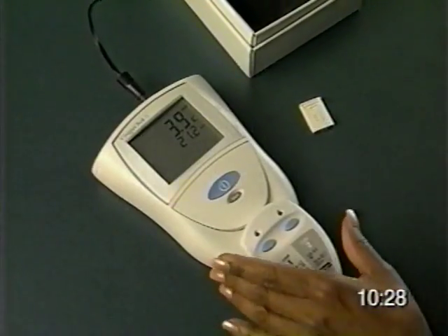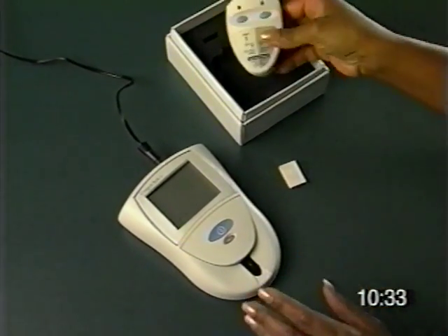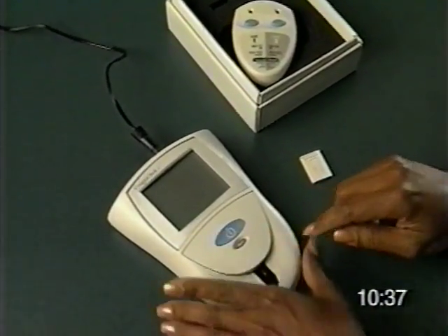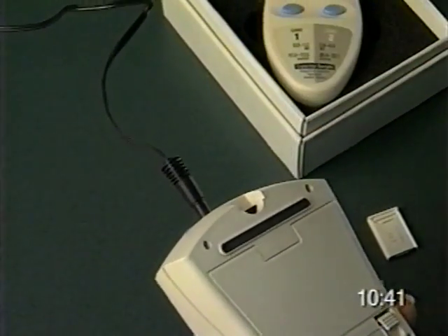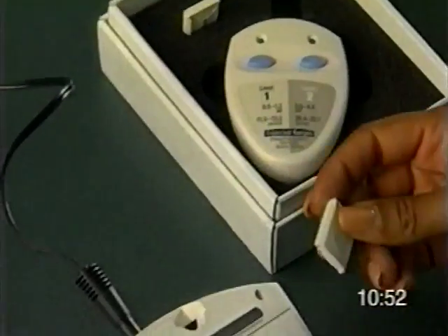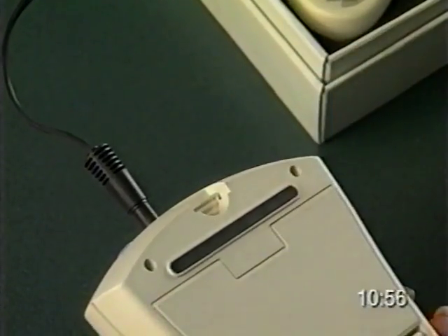When I'm done, I remove the EQC device, turn off the monitor, and remove the EQC code chip. You will not need to reuse this chip. Store the EQC device and code chip in the foam-lined box. Then I reinsert the test strip code chip.